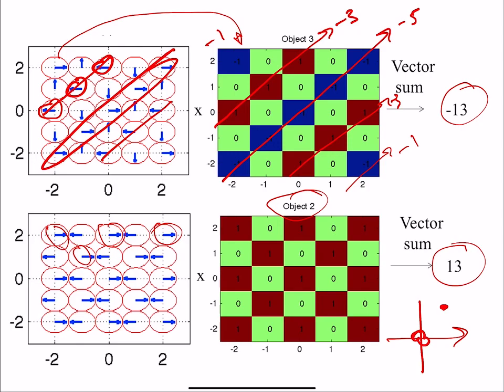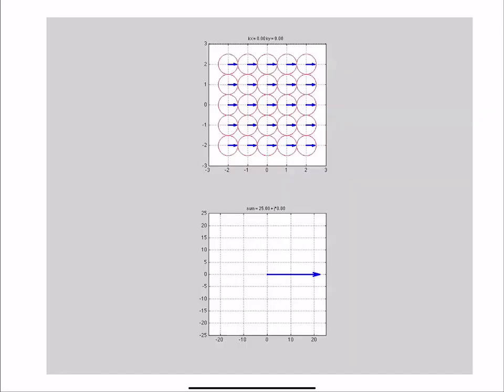Now, it could be that the tissue was rippled, right? For example, along the ribs. MR is not generally very sensitive to bone, but there are forms of MR that are sensitive to bone. So if you image along the ribs, you should see a pattern, and you should see something in K-space that tells you that there's this repeating pattern. Okay? All right, so let's move on.